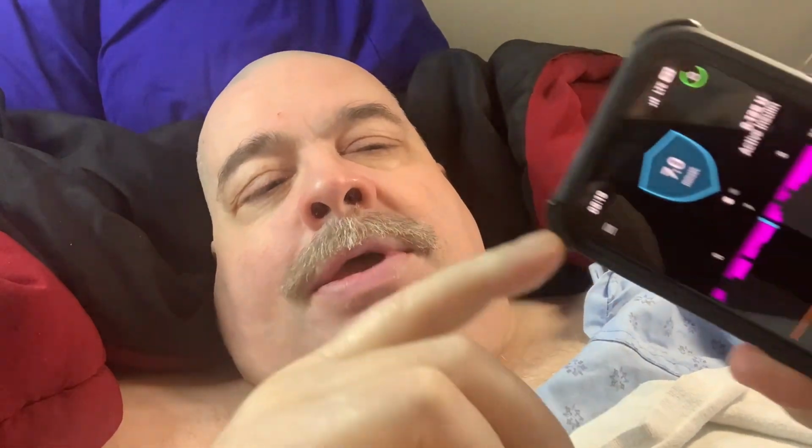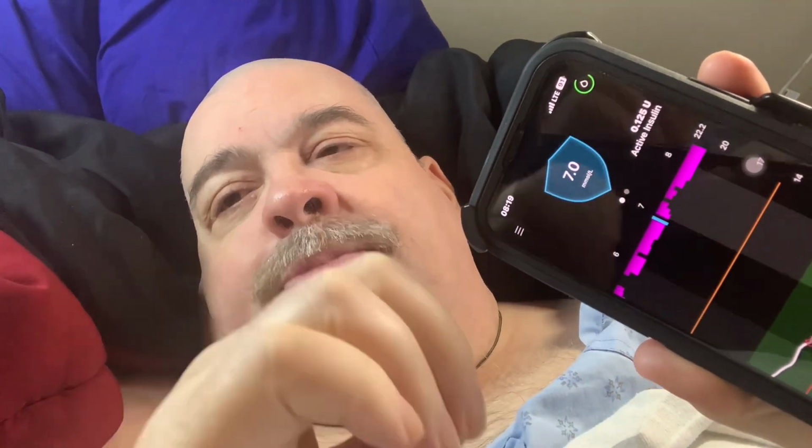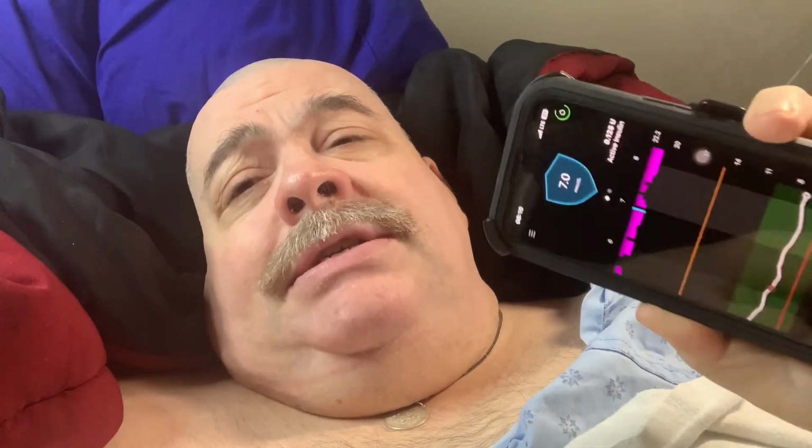Sensors will help you in saying whether you're going high or low, but this number may not always be spot on. And some people get really upset with that. Well, the reason for that is that it's reading two different sources. Your finger pokes, that's reading blood sugar. And again, that number could be different from a blood test, because they're all dealing with sensors, and that's why every so often we check between the two. If you want to, your lab or your doctor will have that test for you.